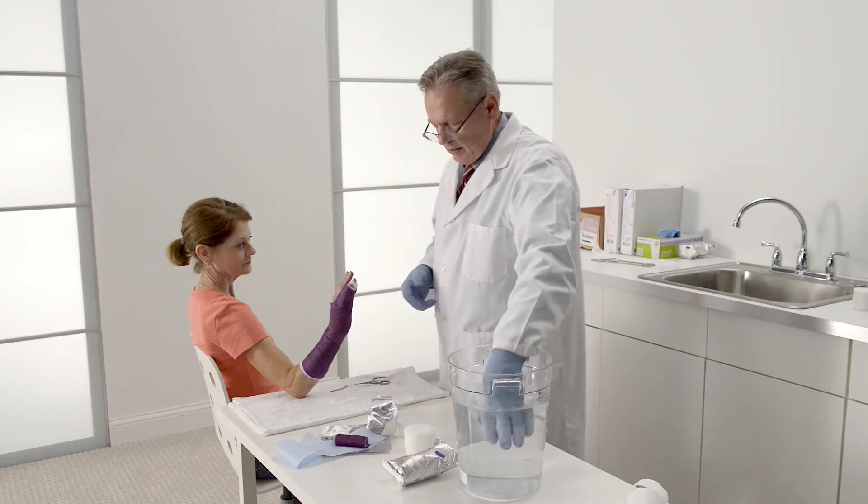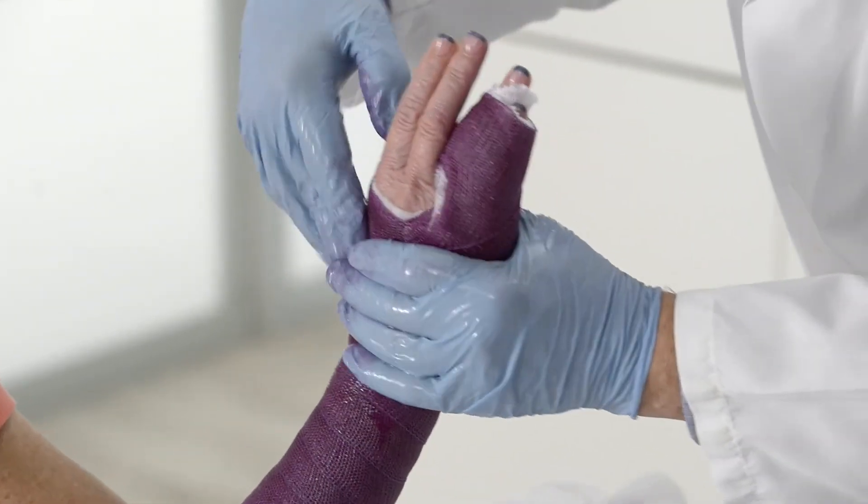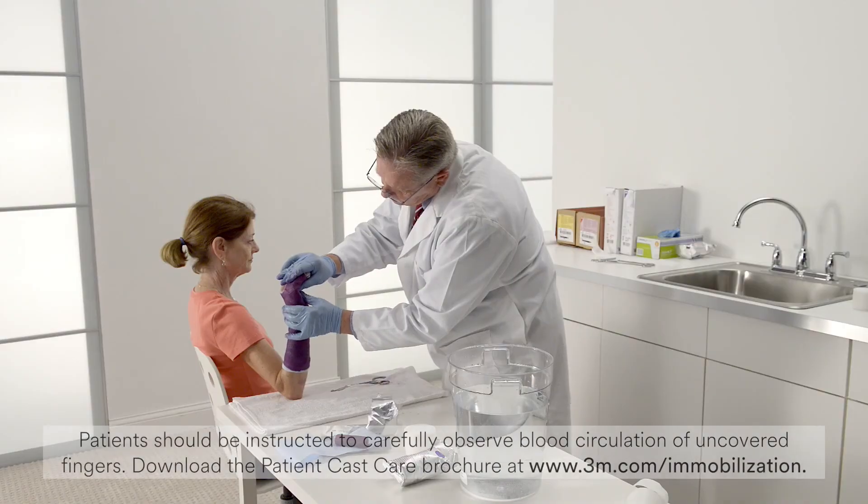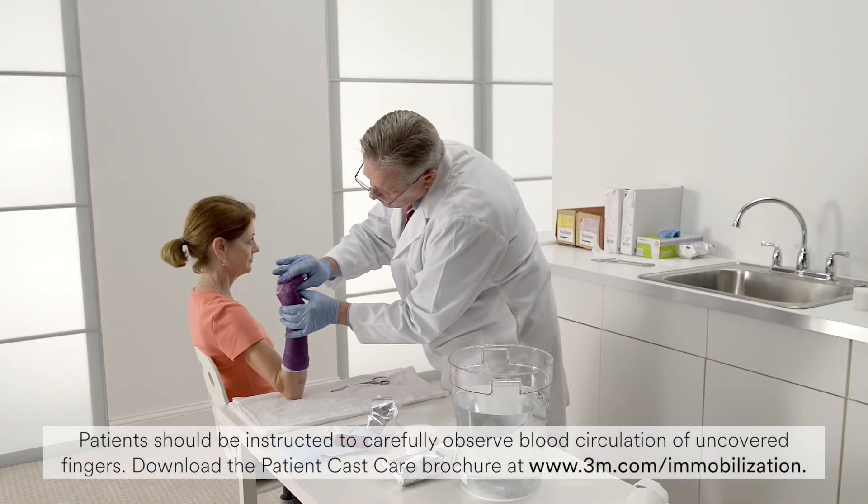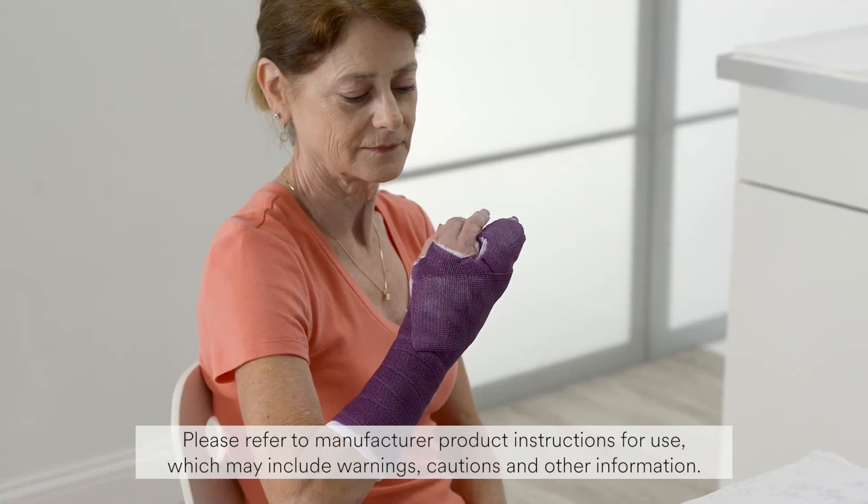Dip your hands in water and mold the cast by placing the flats of your hands on the forearm and apply gentle pressure to achieve the correct mold. The cast will set within three to five minutes and will be fully cured within 20 minutes.